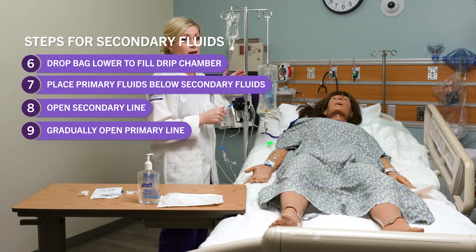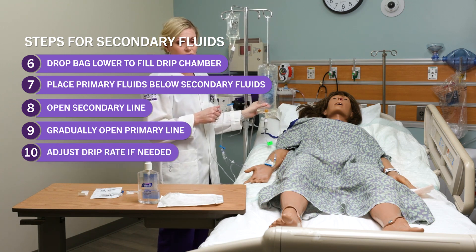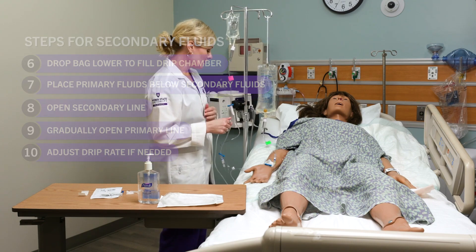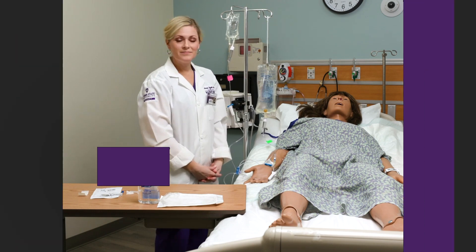You'll want to make sure you're back in the room when the secondary medication has run out so you can readjust the drip rate to the correct rate for the primary line. And that is how you hang secondary fluids.